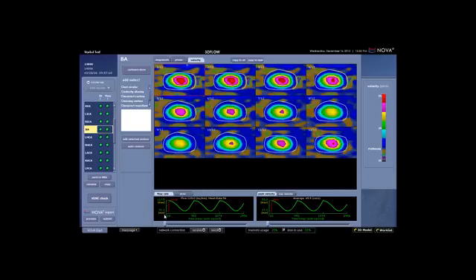At the bottom of the screen, we also show the flow waveform. We've got a volumetric flow waveform where the units are milliliters per minute. We've measured at various points during the cardiac cycle to generate this waveform. And on the right-hand side, we have a velocity waveform, which will have a similar shape to the volume flow.